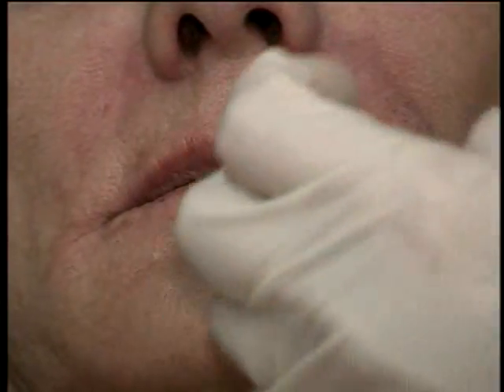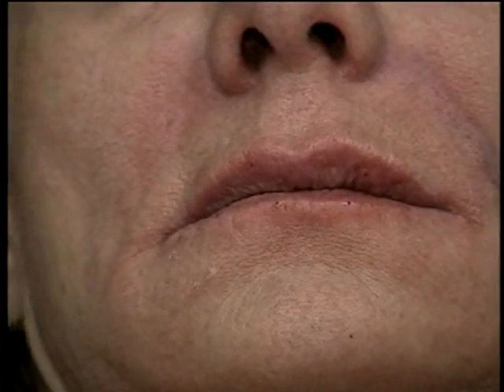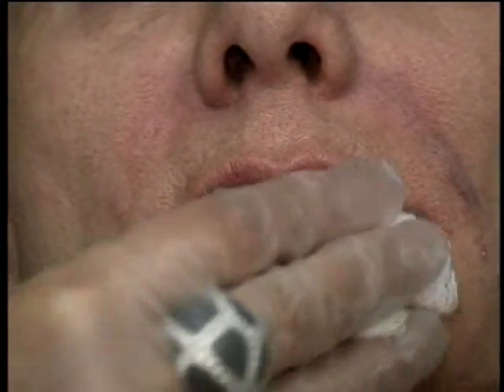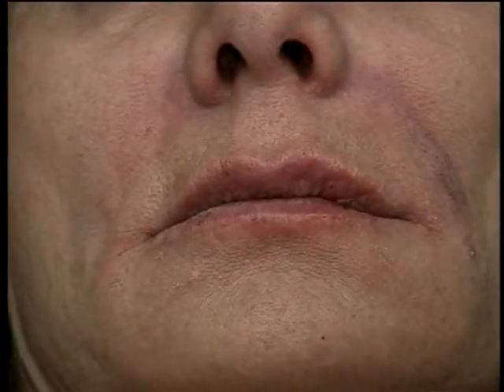She is. Now, of course, you have to recognize that she's got a nerve block, so the perioral muscles are not functioning 100%, so they may have some asymmetries of their lips. Let's say you pucker, so you can see that she's not puckering appropriately, so you have to recognize that this area has a little less function than the opposite area, so it may look a little flatter, but that will come back. So you have to make sure that you put a consistent amount on both sides. Okay, so that's treating the lips.